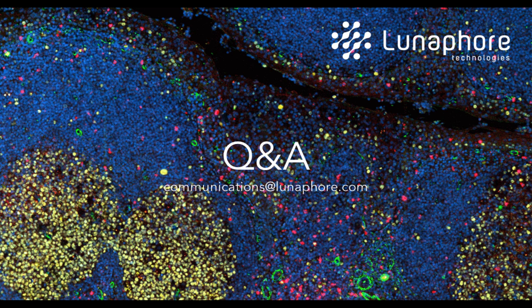Great. Someone else is asking, is it possible to use cocktails of antibodies in a single staining and imaging cycle? Yeah, this is a very important question. As I showed in the presentation, we designed the experiment so that we can target 2 markers per cycle of off-the-shelf antibodies, normally of 2 species, typically 1 mouse, 1 rabbit. So yes, we can cocktail, but they don't necessarily need to be mouse and rabbit.